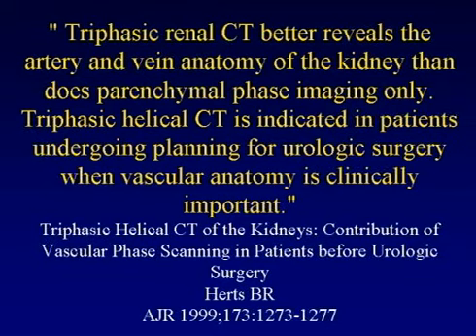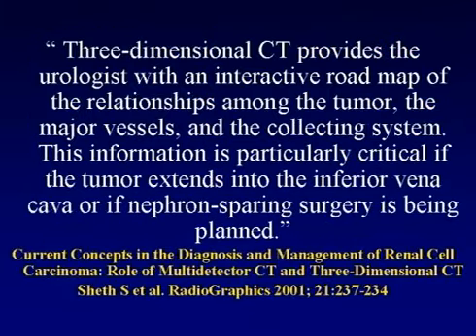A lot has changed over the years. A lot has changed over the time Dr. Bosniak has been in radiology. The changes really have been the last few years in terms of CT, the changes in terms of how we practice, how CT impacts. Two references. Here's one talking about 3D mapping for urologic surgery. In our institution and many institutions, surgeons will not do partial nephrectomies or classic nephrectomies without 3D CT staging in advance. The ability to detect the extent of disease, the ability to show all the information in a single comprehensive study is critical.